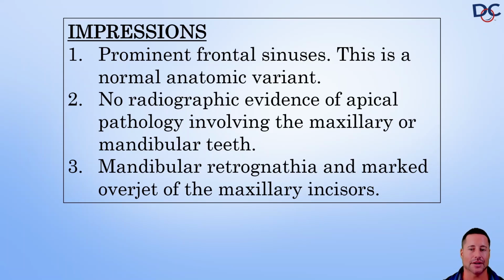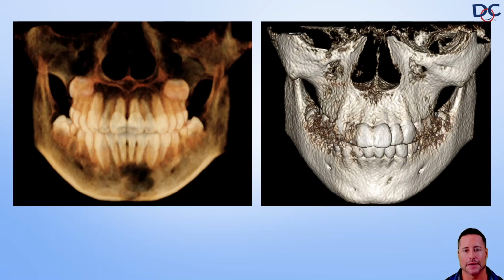So if early on in your career doing this, or early on in your journey doing this, you want to send these, err on the side of caution, by all means. I mean, obviously, you either have to bill the patient or you have to absorb that cost. But if that helps you learn it, then by all means. But the feeling that you need to have every single one of these read by a radiologist just isn't, to me, I don't understand it.